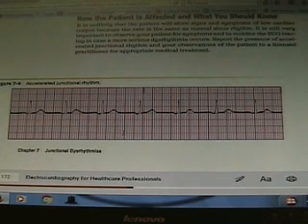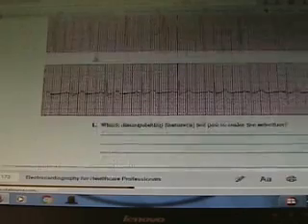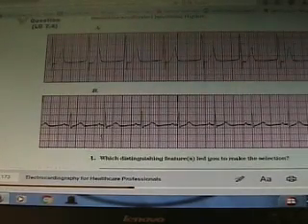Or how about this? I can tell you outright there is an abnormal trace. Is it the P, QRS, or T? And then you look at it. Oh, the P is sometimes non-existent, and on these other ones they're upside down. Then I know it's a P wave problem. See, this one's easy. This one's easy to detect.